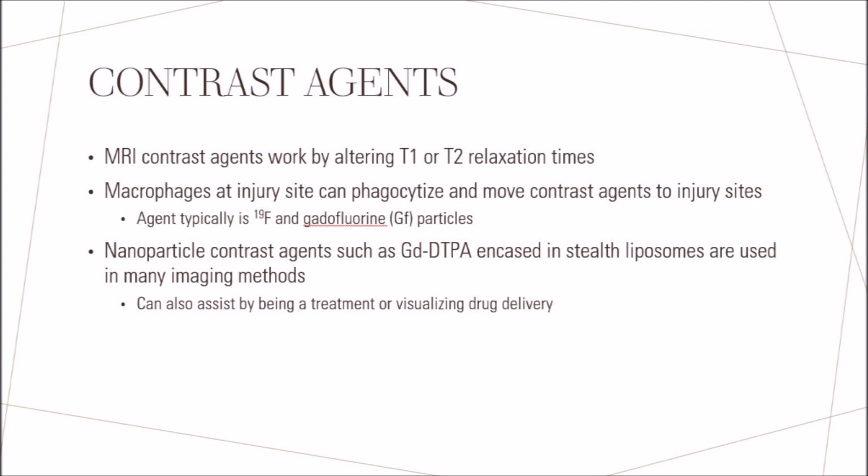In MRI, contrast agents typically work by altering T1 and T2 relaxation times. Recently, new nanoparticles that can be created in the lab can also be used as a treatment or can also be used to visualize drug delivery.